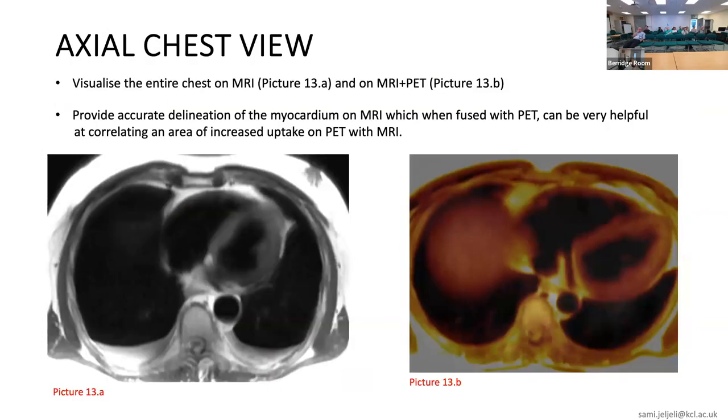To this imaging, we can add the FDG PET. So we can much better locate where there is the uptake that we expect from an infection. Consider that the patient also needs to be prepared with a dedicated diet. It is very difficult to follow a dedicated no-carb diet that allows a complete suppression of the heart. But the cardiac MRI also helps us when there is not a complete suppression, to locate some of the findings, giving us anatomical structures that can correlate with them.